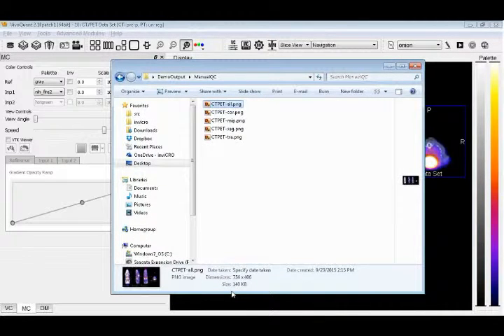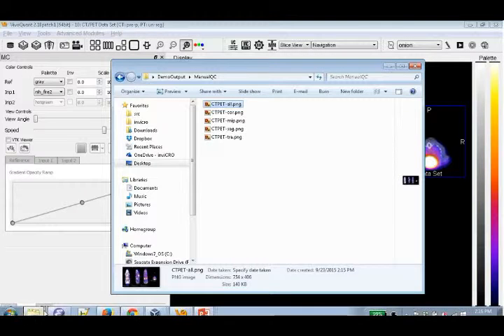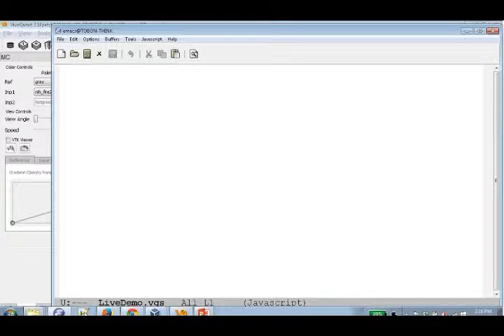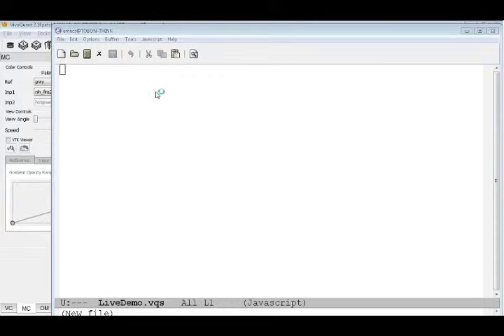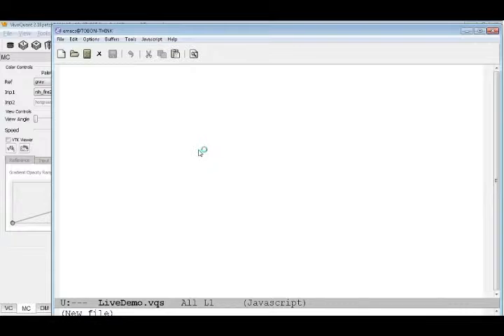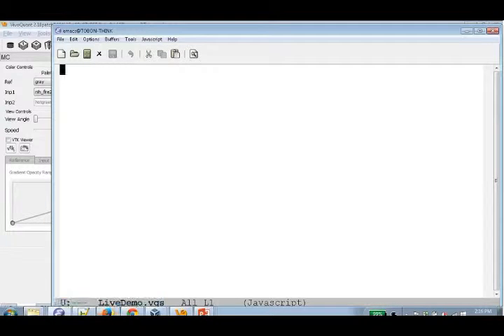JavaScript, like most programming languages, has a looping functionality. I can loop through my entire iPACS project and just quickly get QC images that way. So you'll start by picking your favorite editor, whatever it may be, as long as it's not Microsoft Word or something like that. MATLAB editor would do just fine. Notepad++ is good, but I'm going to use my favorite, Emacs.